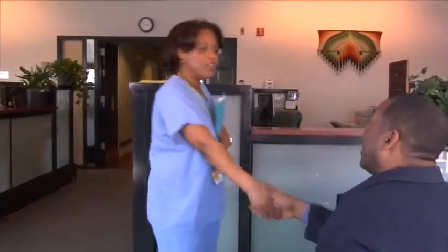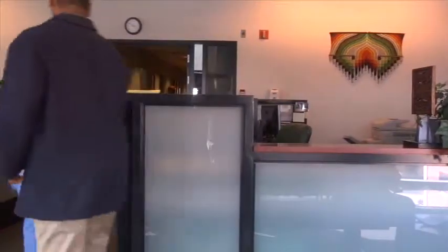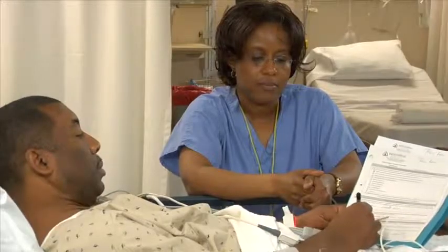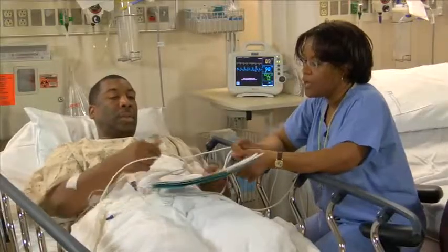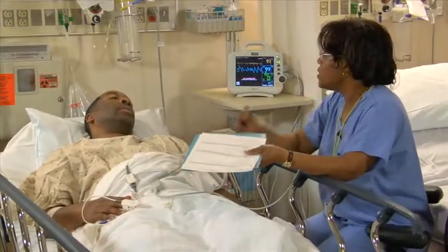An upper GI endoscopy can be done in either a hospital or your doctor's office. In either situation, you'll be asked to sign a form verifying that you consent to having the procedure and that you understand what's involved. If there's anything you don't understand, ask a member of your medical team for more information.